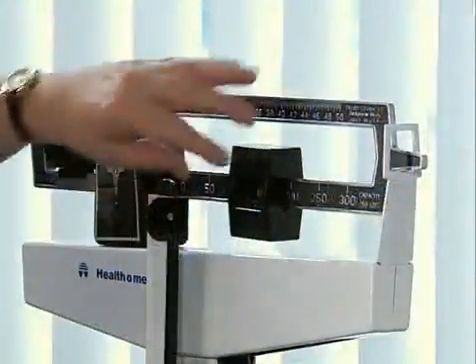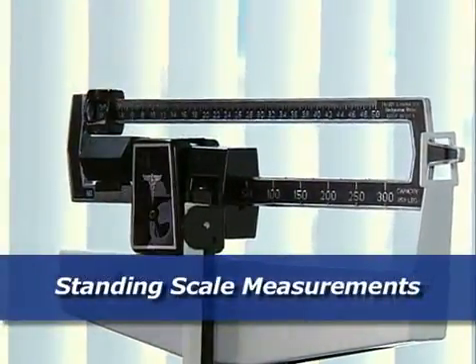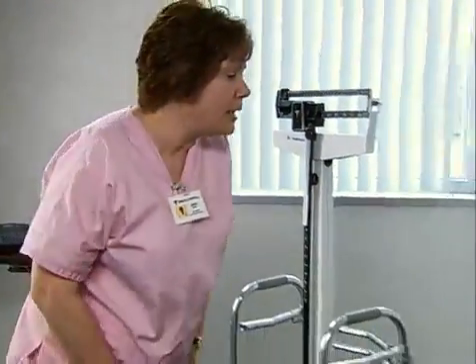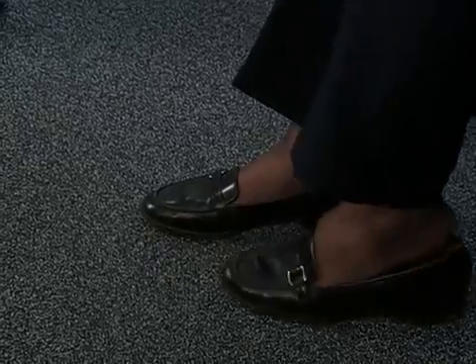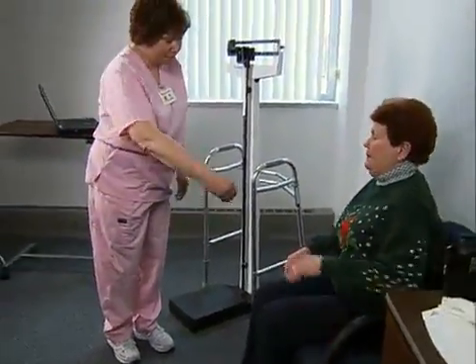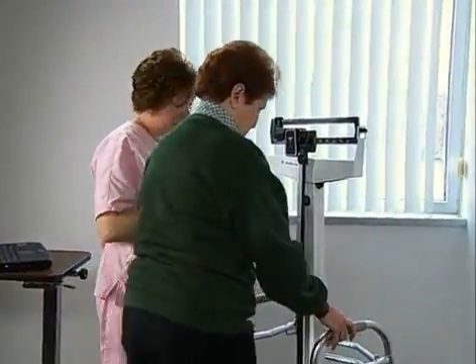To measure the height and weight of an ambulatory patient, prepare the standing scale for use by moving the weights to the 0 notches and making sure that the scale is balanced. Have the patient remove her shoes and make sure that she is wearing the same type of clothing as for previous weights. If needed, assist the patient onto the scale. Have her stand still with her arms at her sides.